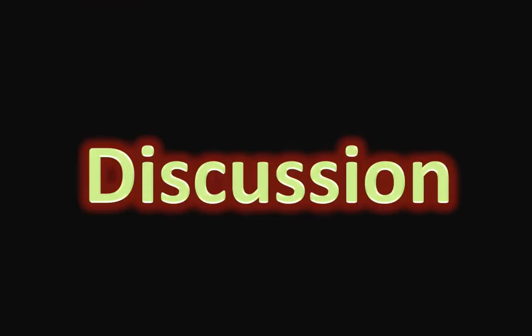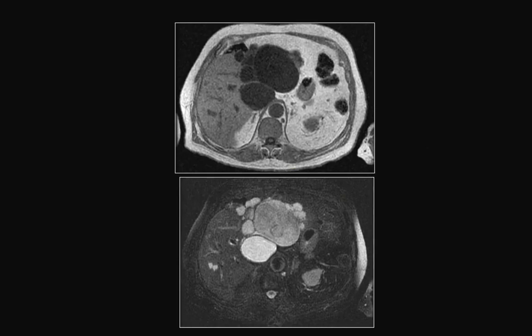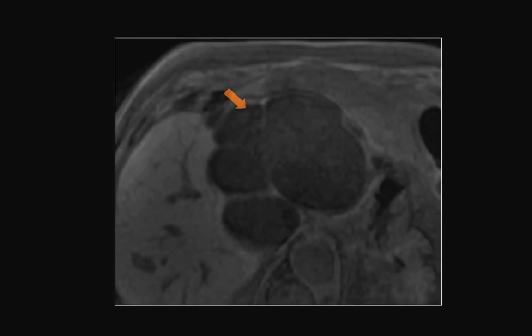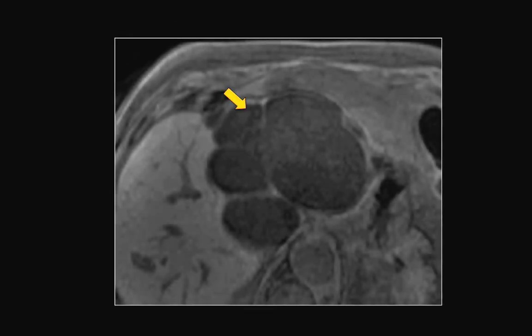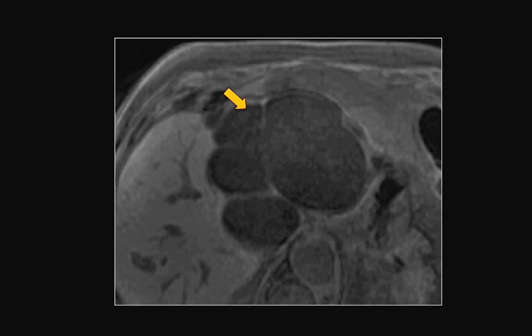Now to the discussion part. The left liver lobe is involved by a large multi-loculated cystic lesion that shows homogenous low signal intensity on T1 acquisition, high signal intensity on T2 acquisition, with a well-defined and smooth border. The lesion does not show any obvious enhancement apart from questionable thin rim enhancement of the capsule.